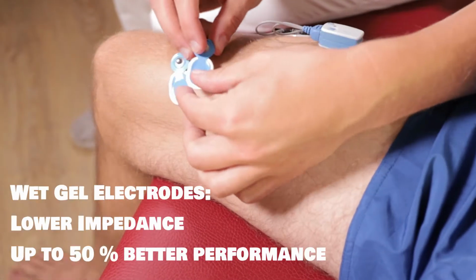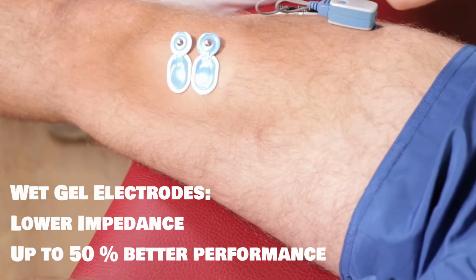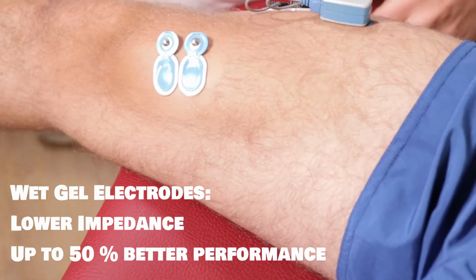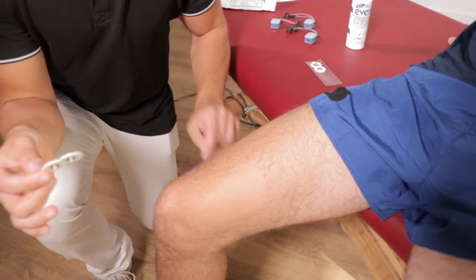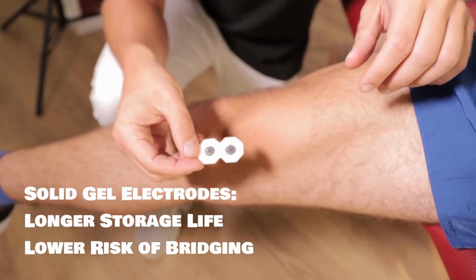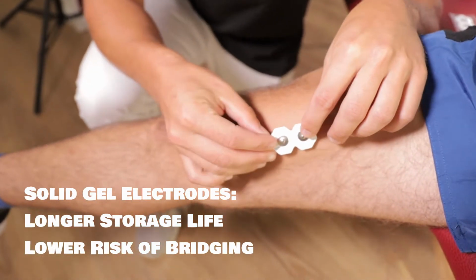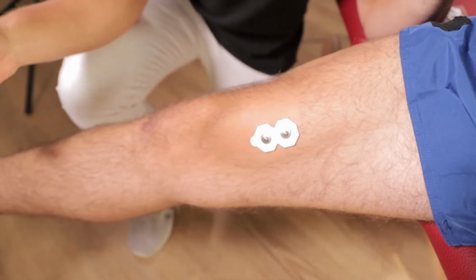Compared to solid gel electrodes, wet gel electrodes typically have up to 50% better performance due to their lower impedance. On the other hand, the solid gel electrodes have a longer storage life, as they don't dry out as fast as wet gel electrodes. Furthermore, the risk of bridging is minimized with solid gel electrodes.